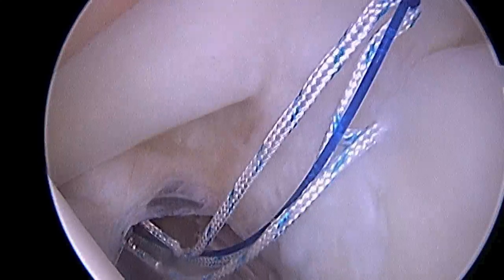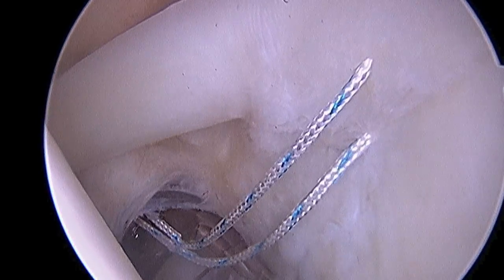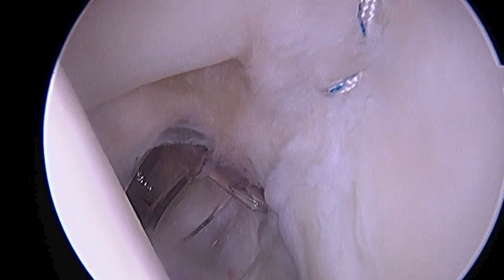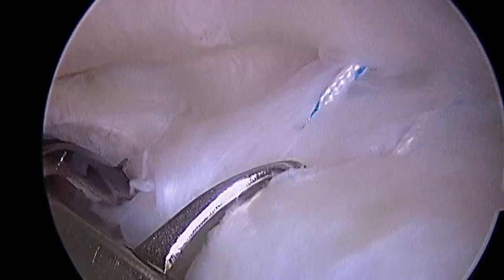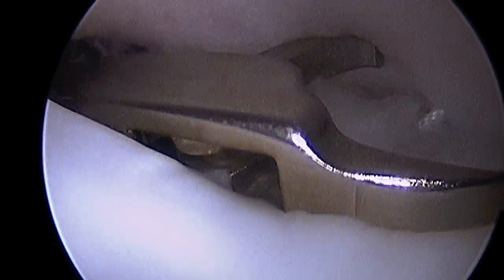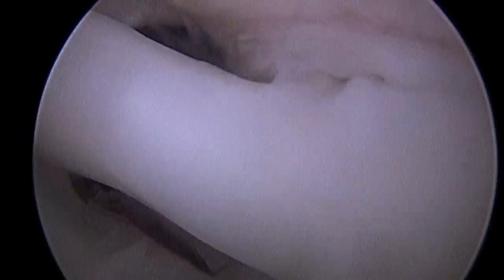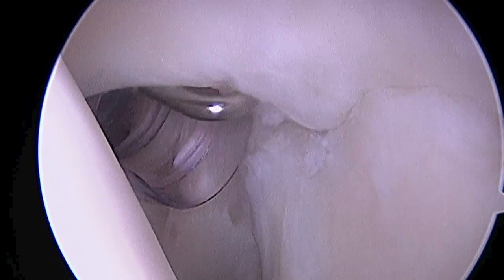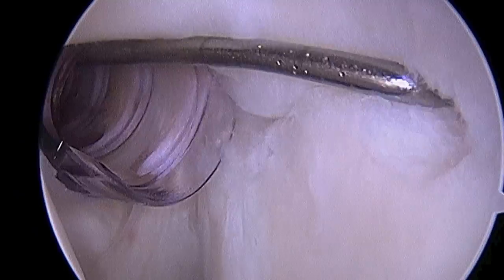Now we've passed a second traction stitch and are passing the second stitch from the same anchor through the anterior portion of this superior labral tear. Now what we have to do is retrieve those arms of suture from above the labrum — there you can see them as they exit the labral tissue. Then we're going to tie down those stitches; you can see a knot pusher there. You can see how that restores the stability of the anterior portion of the superior labrum.